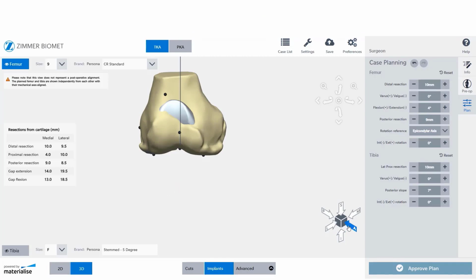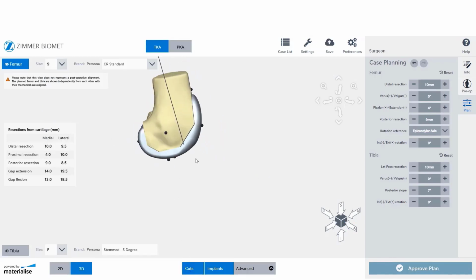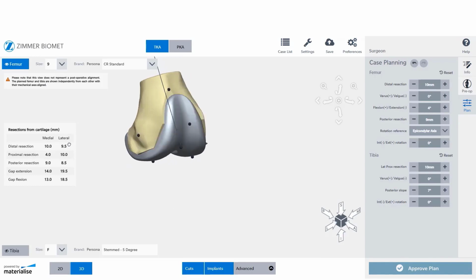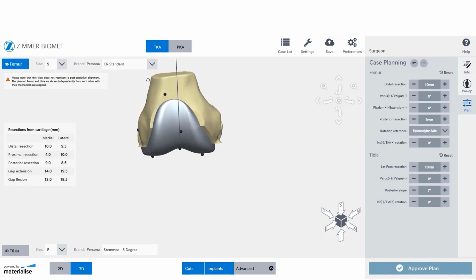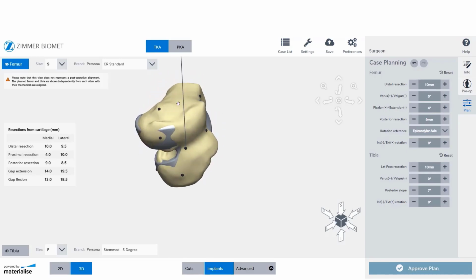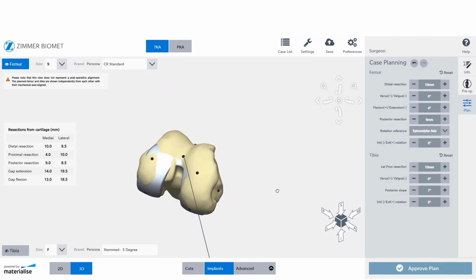To find the optimal size for your patient, there are a couple of things you can consider. You can try one size bigger and one size smaller. Check that there is no notching or limited notching. Review there is no anterior overstuffing. Assess implant overhang onto osteophytes.